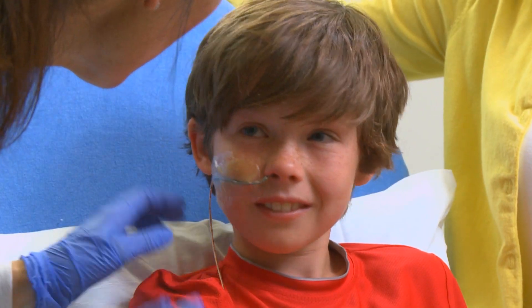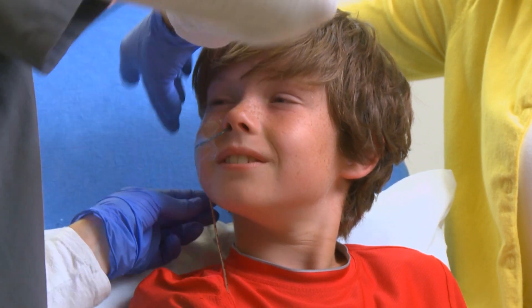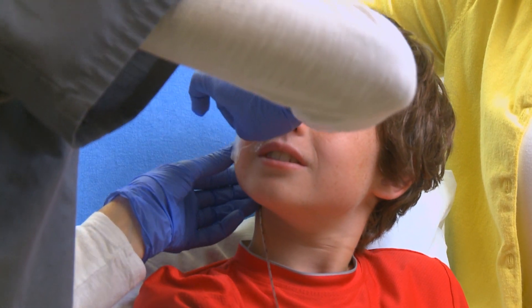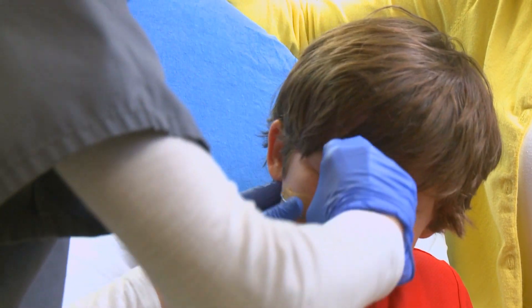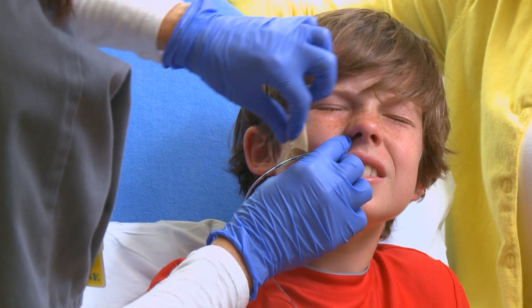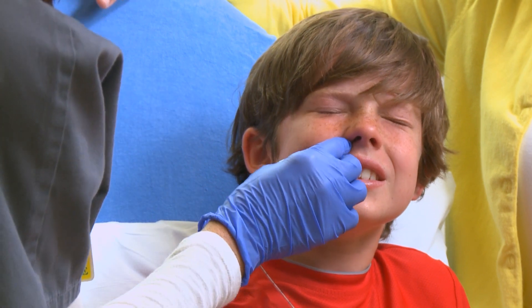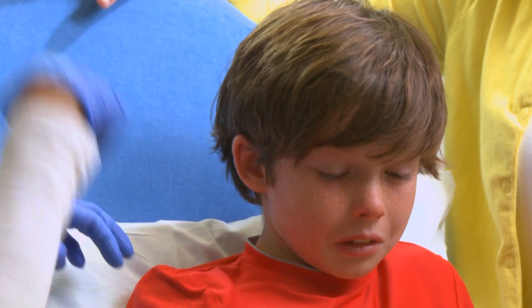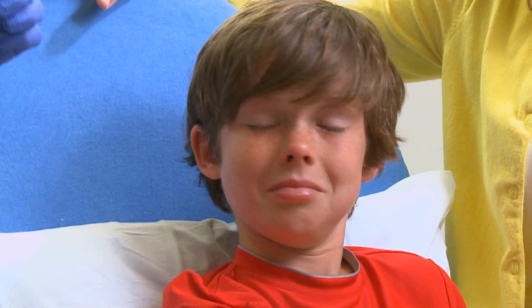Now we're going to take it out. First thing I'm going to do is remove the tape, just like a bandage coming off. You may sneeze sometimes when it comes out too. I'm going to take the tape off, and on the count of three, I'm going to pull it out. It's out. Good job. Great job.